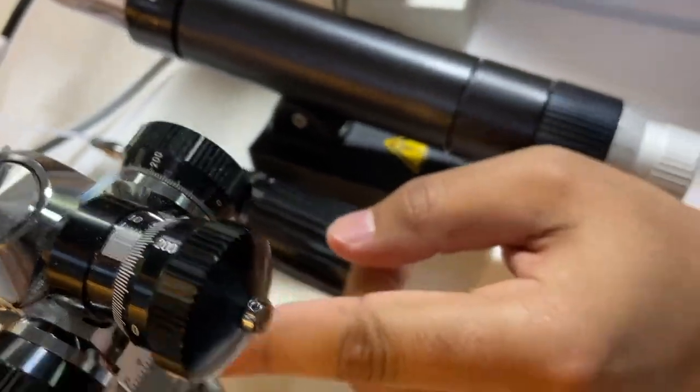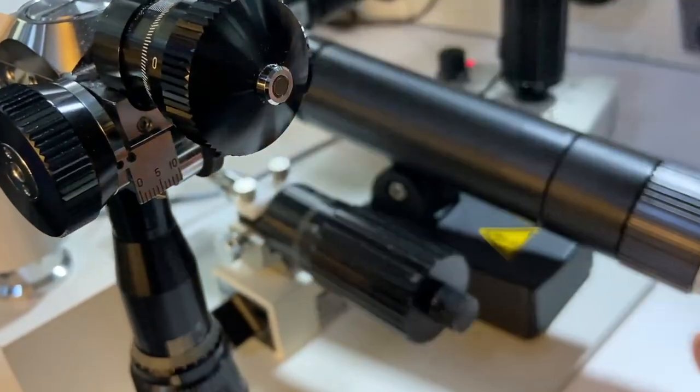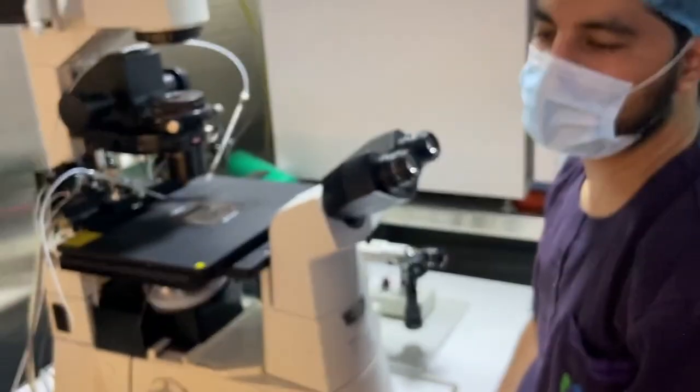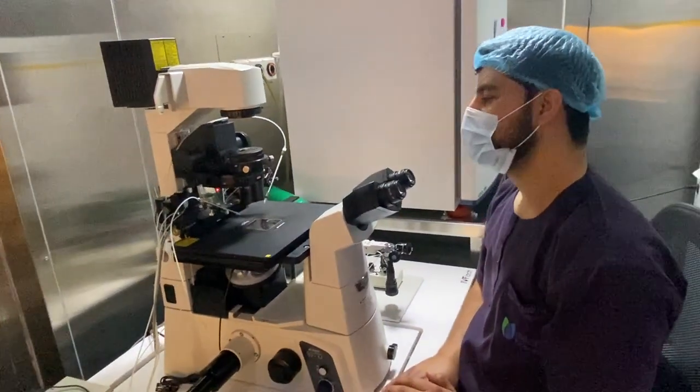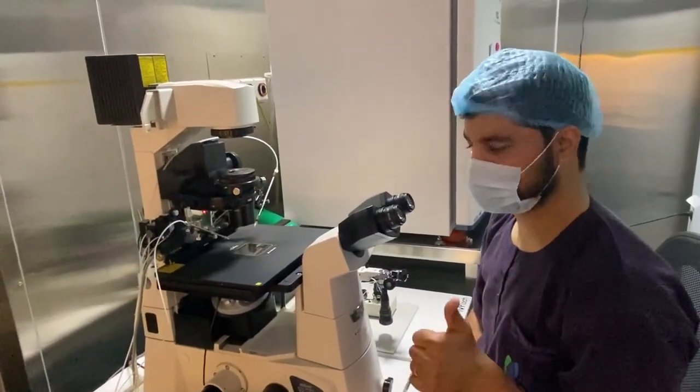The same thing we have to check here. It is almost at 5 only, that means in the middle. Then it's all set now. The next thing will be to take the injecting and the holding needle and use them to align properly.